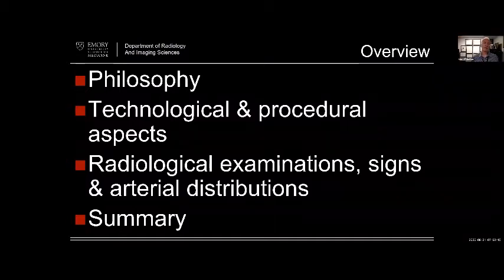And not only is it a common process and a common pathology and a common presentation, but there's the opportunity for you to really play a part in helping that patient as you go forward. So I'm going to go over some classic presentations. I'm going to give you what I think are some pearls and pitfalls along the way, and we will see a few cases along the way as well.